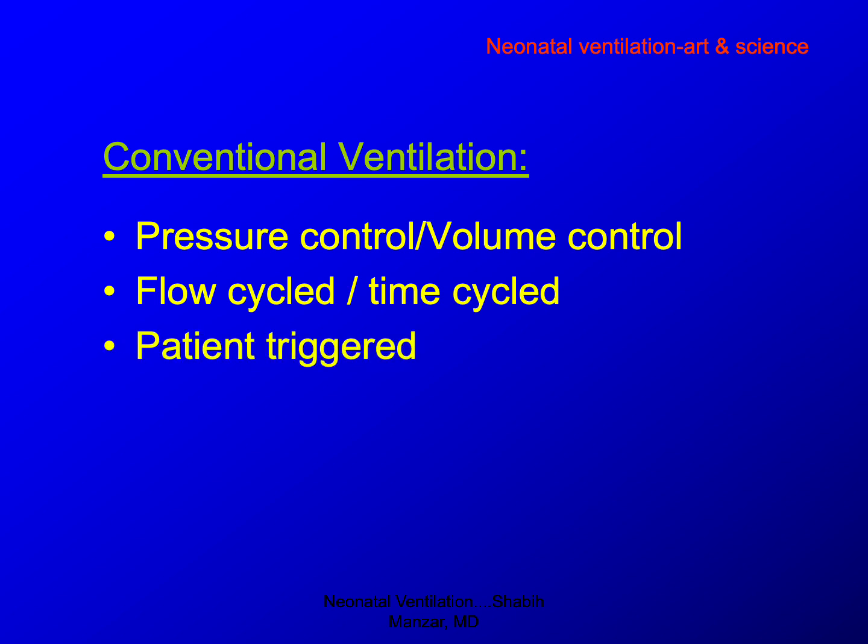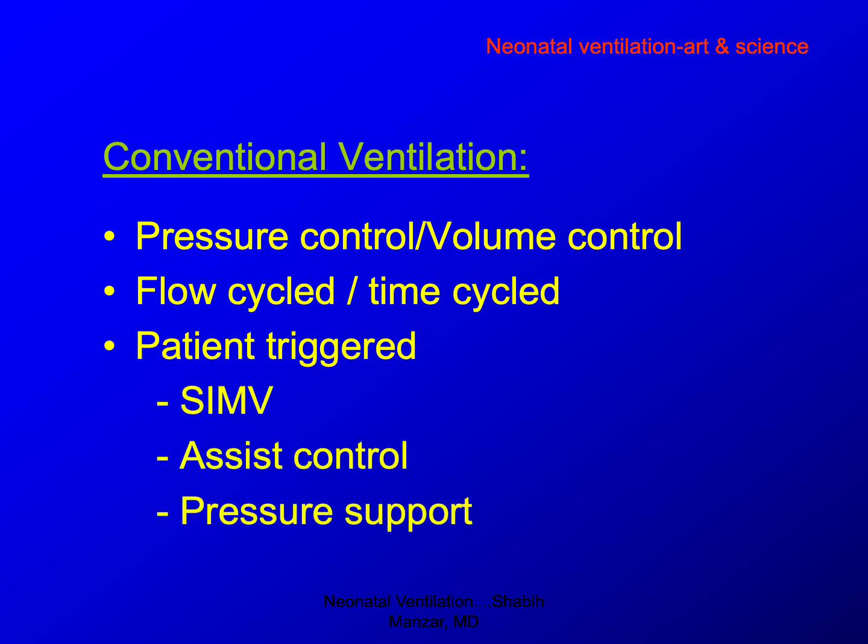Patient triggered: instead of you taking the control, and this is the strategy we have been using for a long time now. But like I said, 40 years back, people were paralyzing neonates to ventilate. Now gradually we realize ventilation when the patient is awake is much better, and when the patient is awake, it's better to have patient-triggered ventilation. It's just like the analogy of the side wheels on the bike, and gradually you take them out and let the patient do the thing, rather than the ventilator doing everything for the patient, or the infant in our case.